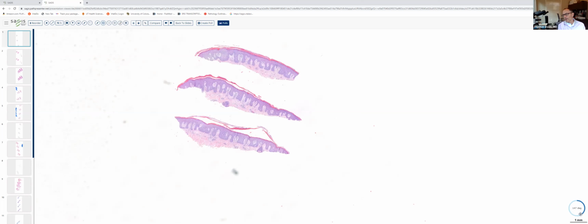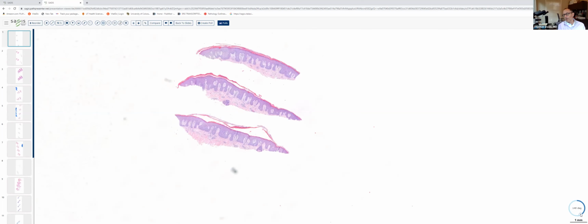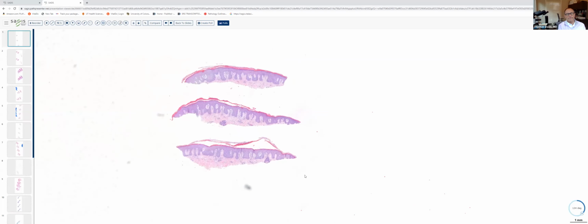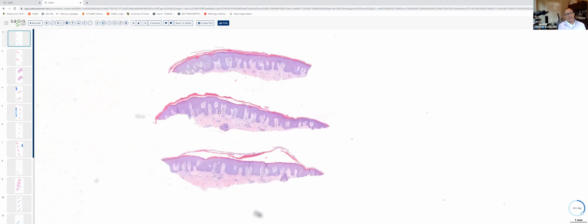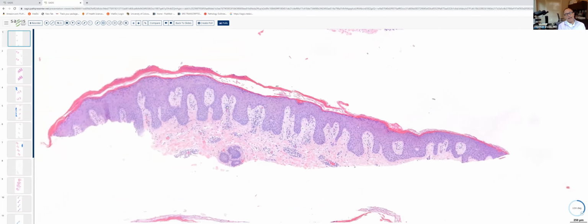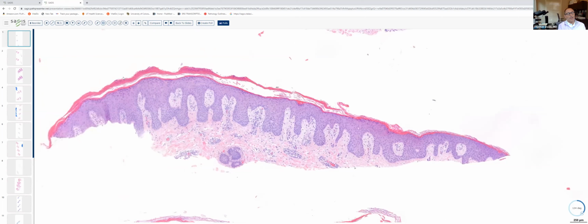So we're in the psoriasiform category, which of course tends to be associated with papulosquamous conditions. The epidermis here is uniformly hyperplastic. As we move to higher power, we can see some dilated vessels in the papillary dermis and quite a bit of parakeratosis that's focally confluent within the stratum corneum, so one could begin to think about the possibility of psoriasis here.